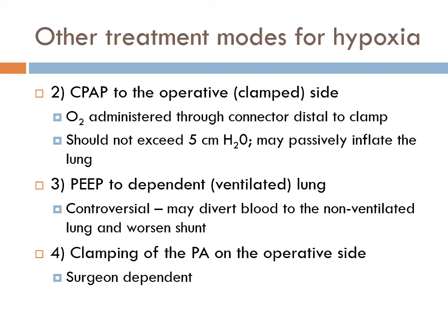There are devices that do this, and you can actually measure out what your CPAP is. But you can put the Mapleson circuit or the Jackson Rees up to here. It fits just like it went onto the endotracheal tube. It's the same diameter. It clamps onto here. You're going to put a couple liters of oxygen to it, and those circuits actually have an APL valve. It says close, go this way, and then you assume if you go the opposite way, it opens. You would close your valve off slightly until the bag fills up with oxygen and causes a little bit of pressure, and that pressure is then going to be parallel to the pressure in the operative lung. And you just add a little bit of CPAP to the lung.